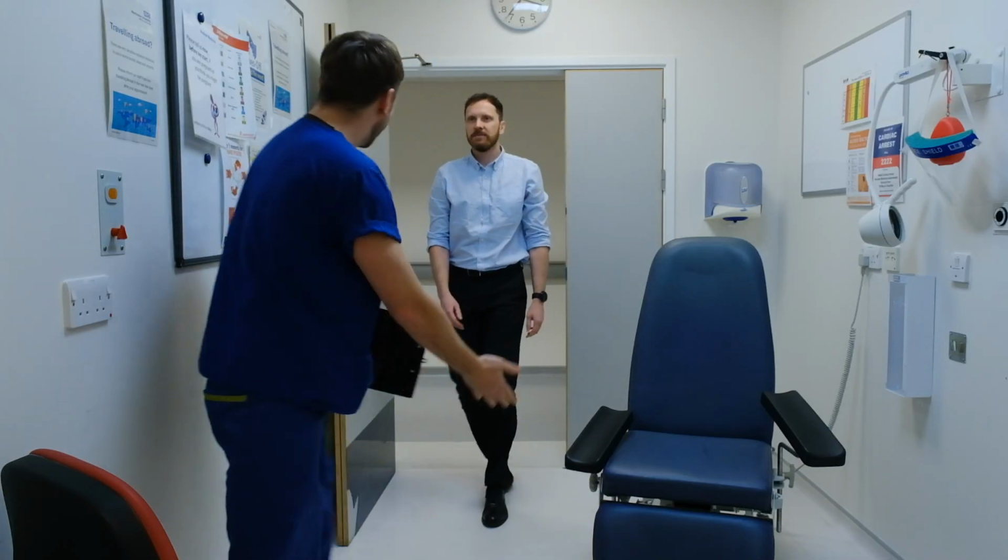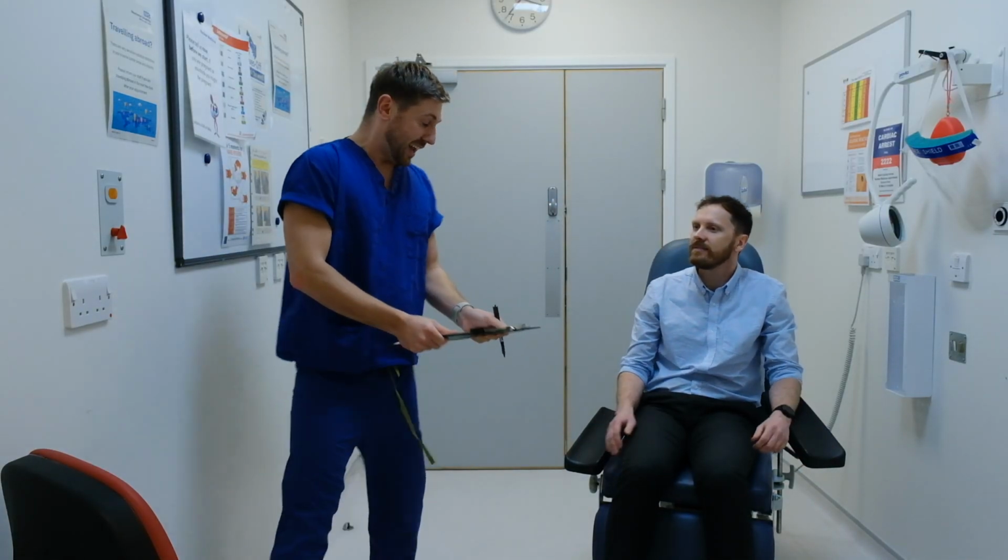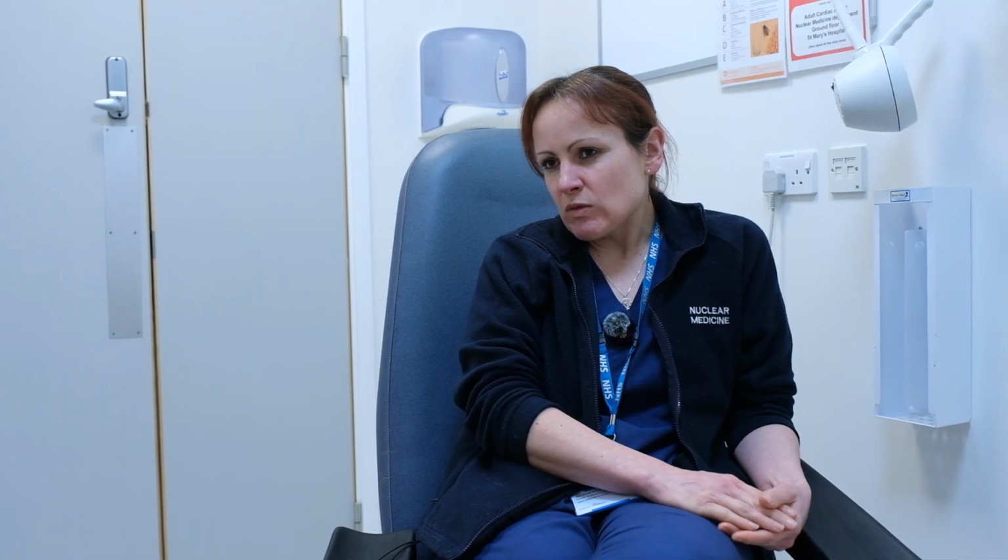We would check the ID of the patient by checking the name, the date of birth and their address. We would then have a chat to the patient and ask them a question to make sure that their clinical history matches what the request says. And then we would explain what the procedure involves. And then we would ask them some questions. In this department, we have set questions that we ask.